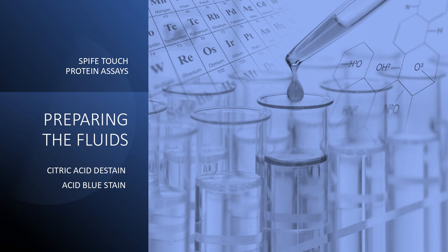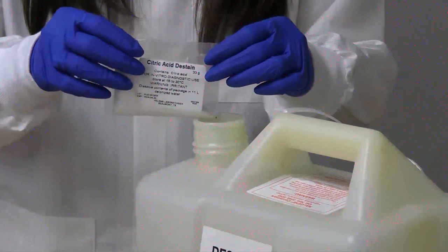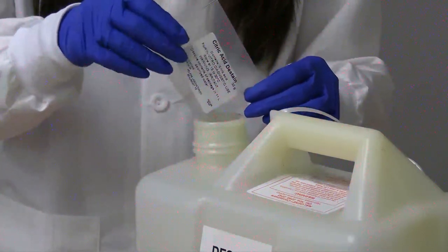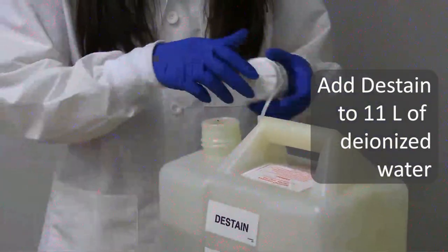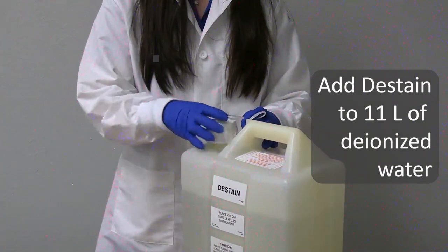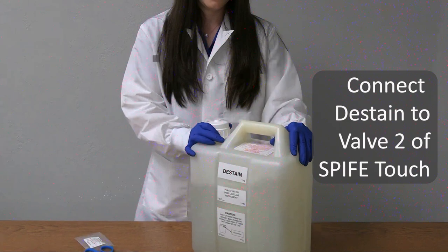Preparing the solutions is a straightforward process, with clear instructions provided on the reagent packaging. To prepare the citric acid destain, begin by filling the large destain vat with 11 liters of deionized water. Pour the destain package into the vat and gently shake the vat to ensure complete dissolution before use. The destain should be connected to valve 2 of the SPIFE Touch.